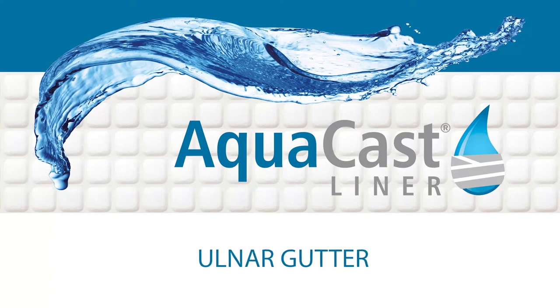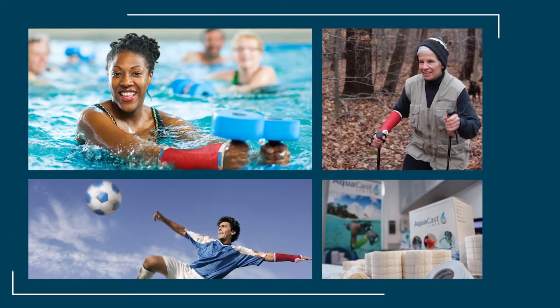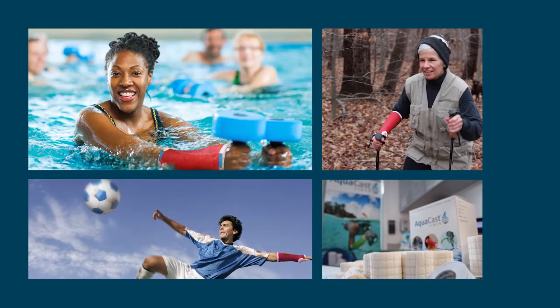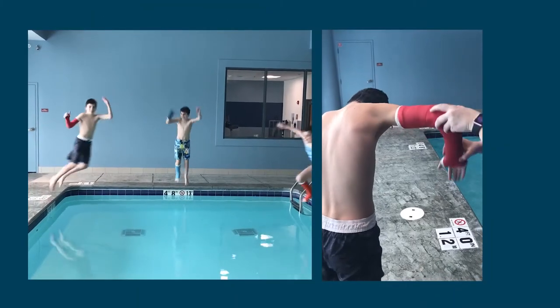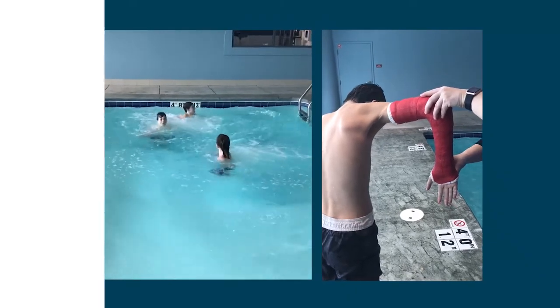AquaCast Liner Ulnar Gutter Cast. AquaCast Liner is a waterproof, breathable material that allows water drainage from the cast and moisture evaporation through it, meaning the wearer can get wet.